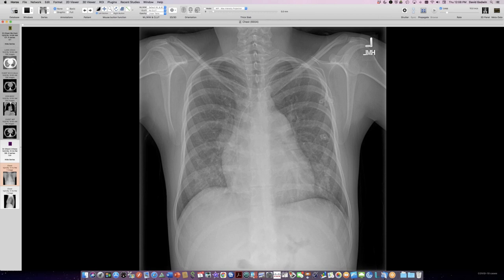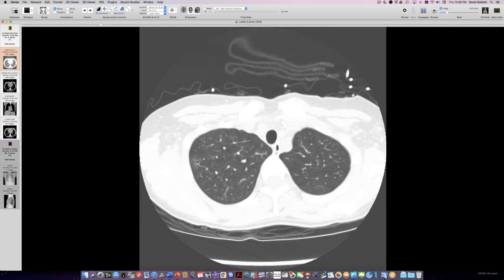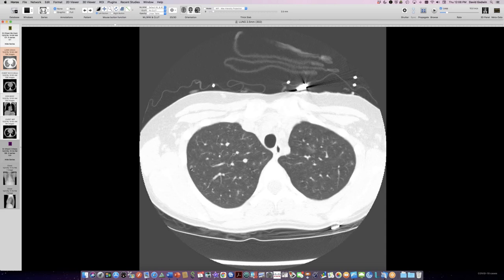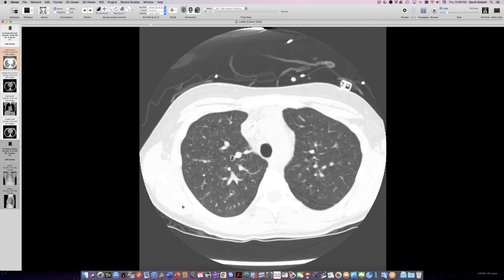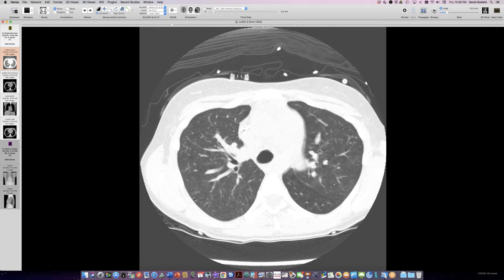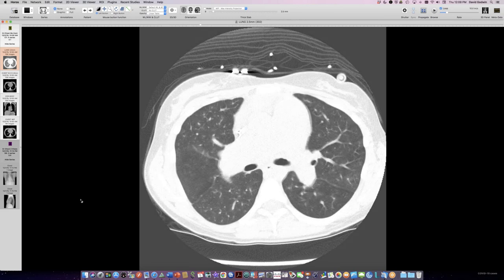So busy looking lungs. She did have the CT scan, which shows some ground glassy abnormalities, and excess of small little dots like this, representing very local aneurysms of these arterioles. So enlarged, some dot-like enlargement, and with surrounding ground glass is what you see with plexiform arteriopathy in the setting of pulmonary hypertension. So here's another one of those little dots. So these sudden changes in caliber of the vessels and then some smudgy ground glass around it. It's great for plexiform arteriopathy.